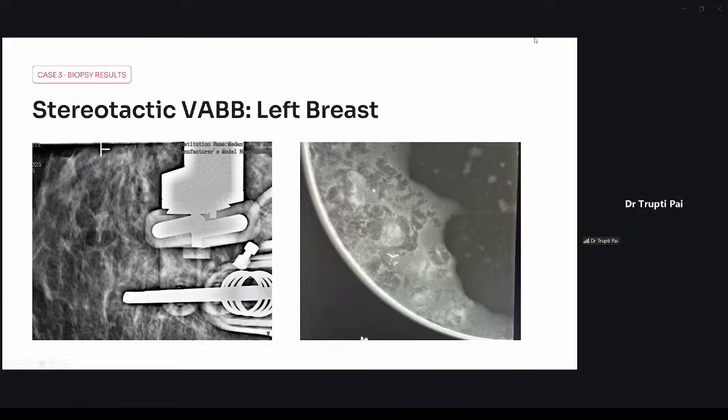One we can easily see and one doesn't take up the stain, but on polarizer or maybe on deeper sections we get it. So as a pathology part also we have to quantify the lesion, give exact high grade, low grade features, out of multiple things, in how many sections, some exact quantification, mention of calcification wherever possible.